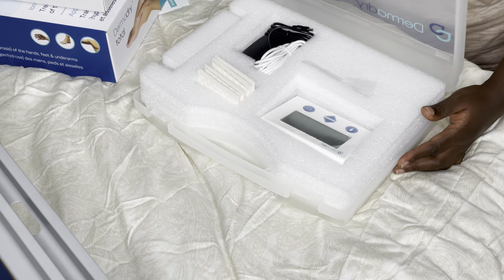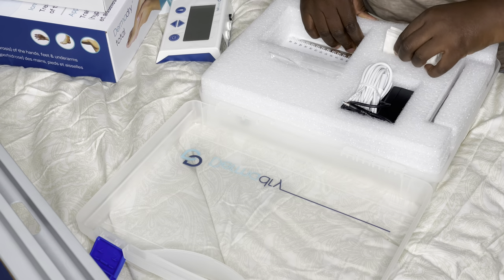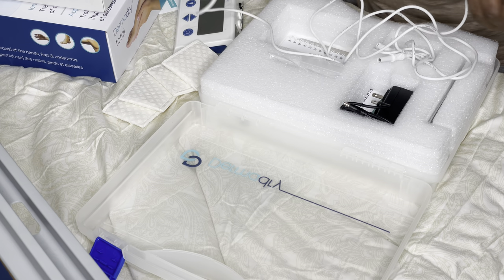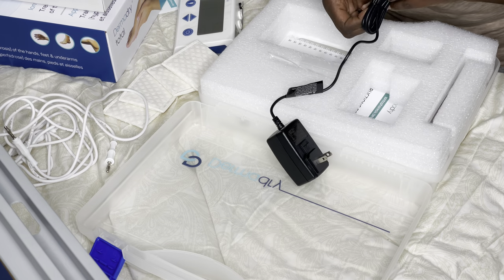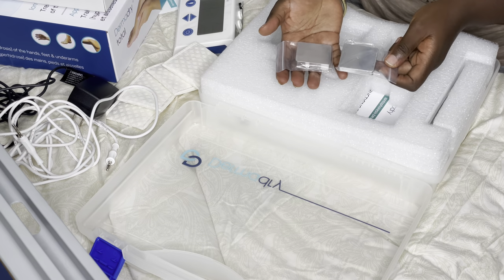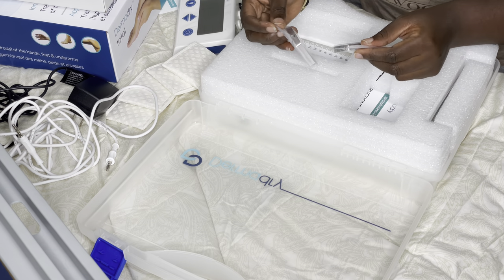The box comes with a controller, hand and foot electrode case, towels, cable pairs, underarm electrode pairs, an AC adapter, a blade plug adapter, underarm pocket pairs, and instructions for use.